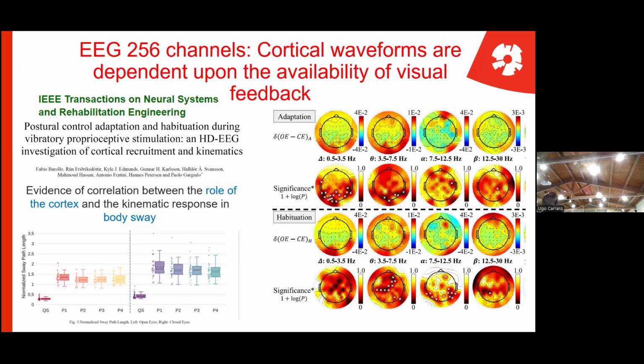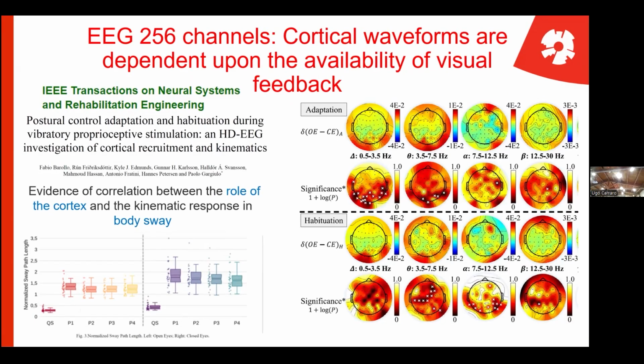So we did that, and what we realized is that to understand the brain electrical response, we need to have a visual stimulus. So when the eyes are open and looking at something, the brain electrical activity is more visible and can be read more easily. Okay, that was the lesson that we learned in these first paradigms.